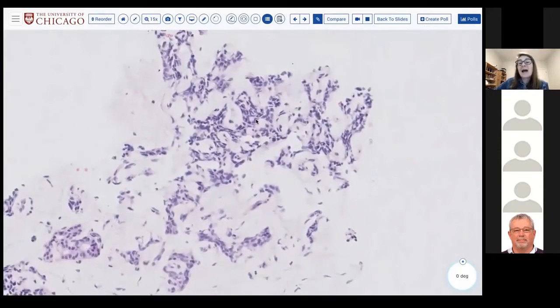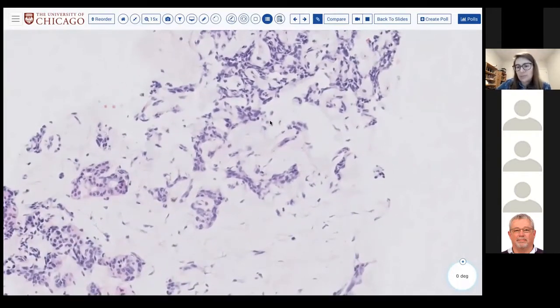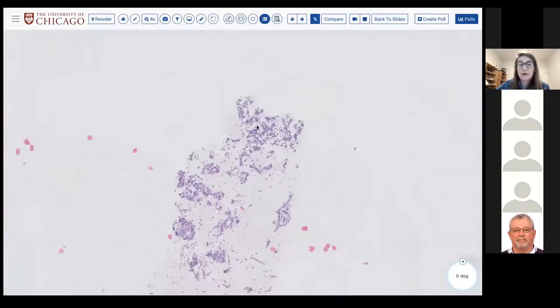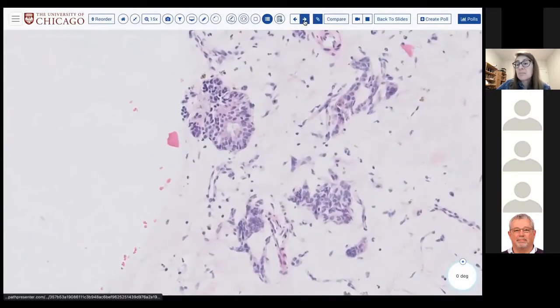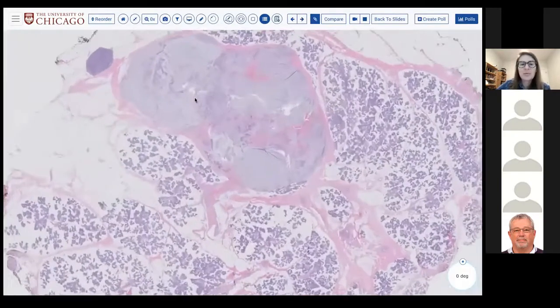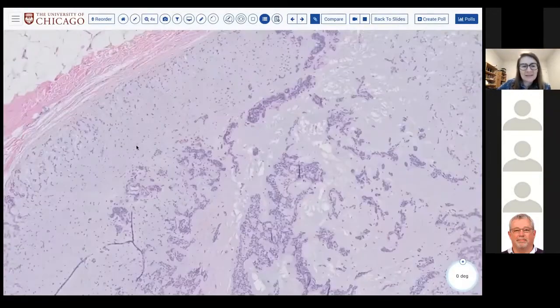And so in the absence of any immunohistochemistry, what is the least we could say? Well, the least I could say about this is it seems to be a paucicellular, very cytologically bland, therefore low-grade salivary type neoplasm. On this type of biopsy, very low-grade paucicellular salivary type neoplasm might be the most you give. If anybody wants to favor a diagnosis, maybe you'll favor what this is, which is a pleomorphic adenoma. This is probably one of the more straightforward cases where you have that diagnostic myxoid stroma.